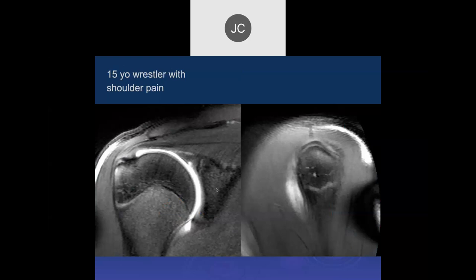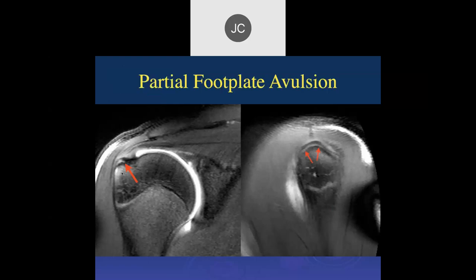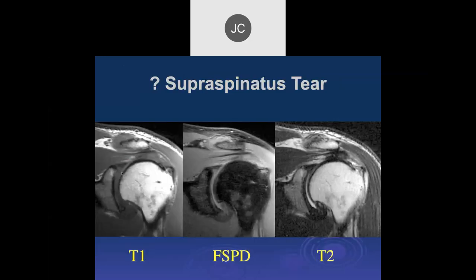15-year-old wrestler with shoulder pain: looking at the supraspinatus, there's a little increased signal and what looks like an avulsion injury with bone edema — a small footplate bone avulsion. What would you do? Just let it heal. Use a sling for a couple of weeks. And if you didn't trust the kid, put him in a swathe so he can't get out of the sling.